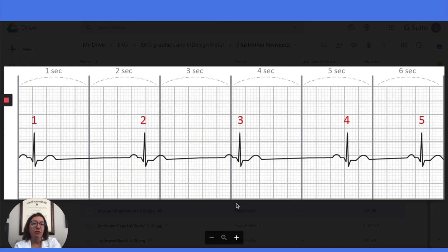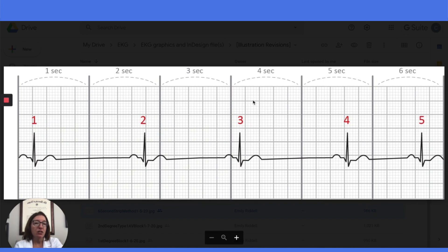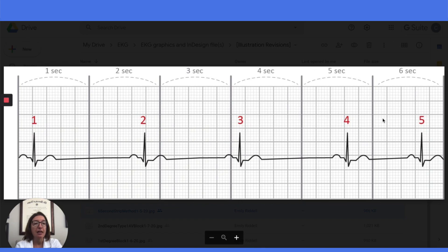Now let's go over the last method for calculating heart rate, which is the six-second strip method. This is the method you will need to use if you are dealing with an irregular heart rhythm. If your rhythm is regular, use the small box method, which is much more accurate. With the six-second strip method, you first want to make sure you're dealing with a six-second strip. Each big block is 0.2 seconds in duration, so five big blocks is one second, meaning you need 30 big boxes for a six-second strip. Then count the number of QRS complexes within those six seconds. In this example, we have five QRS complexes, so we take 5 times 10, which gives us 50 beats per minute approximately.